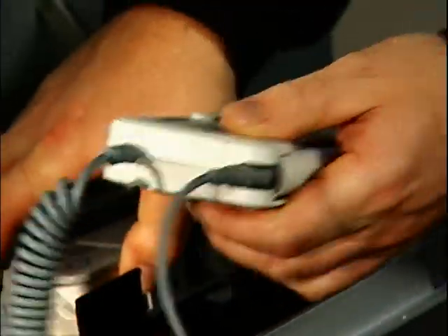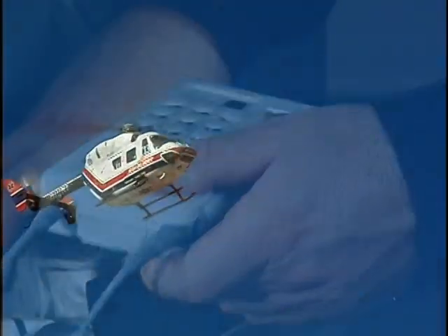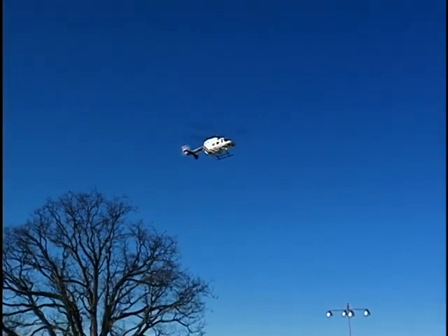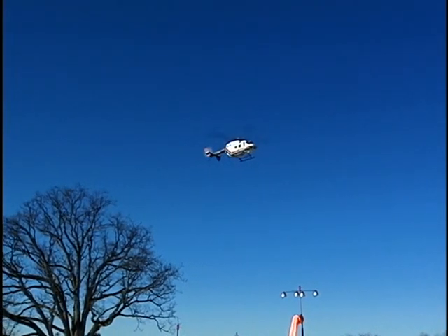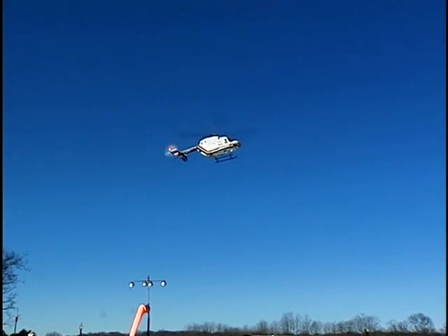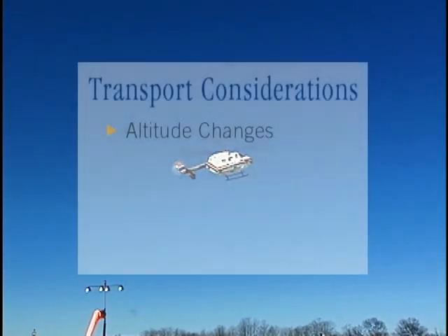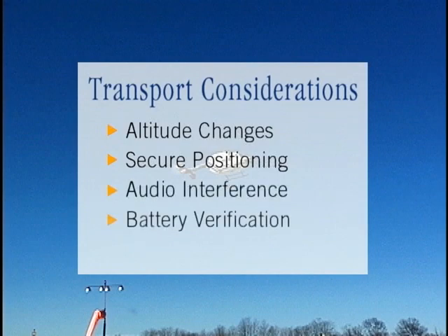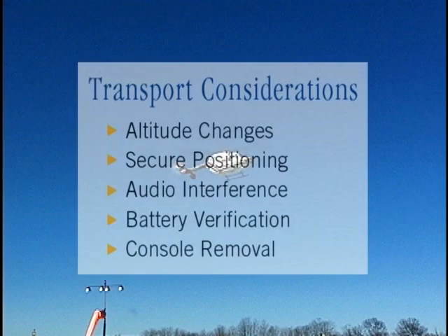Since the CS100 is battery operated, it can be used in situations where the patient must be transported or where AC power is not available. Specific recommendations that should be followed when the CS100 is employed in portable operation deal with altitude changes, secure positioning, audio interference, battery verification, and console removal.